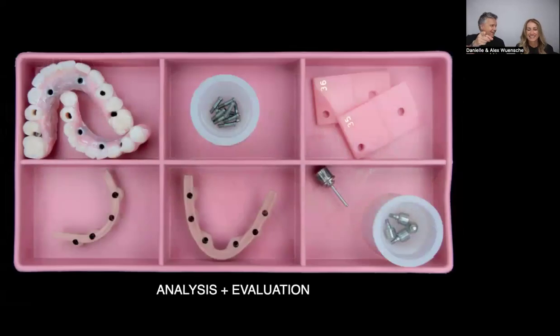Oh, you love that. I know that. Yes, I love this slide. I love color pink. No, but I just love it for the organization. Basically, you're going to a wax try-in and a bar try-in with all the important tools, all the important pieces. So it's very important to be organized when your patient comes in.